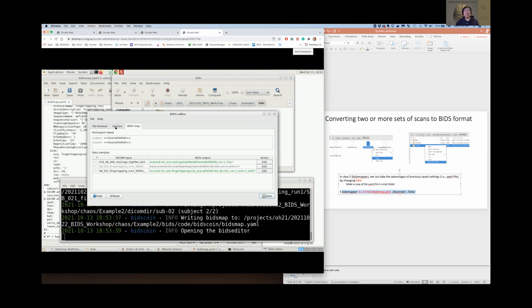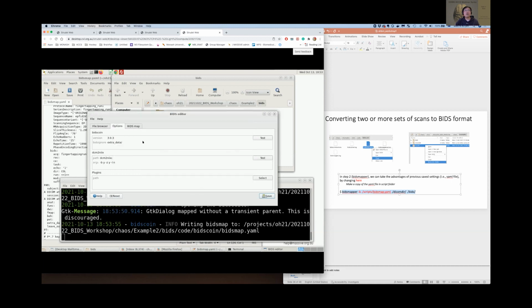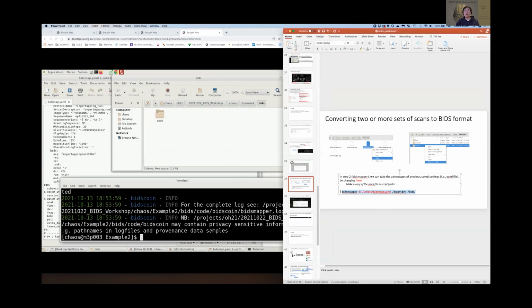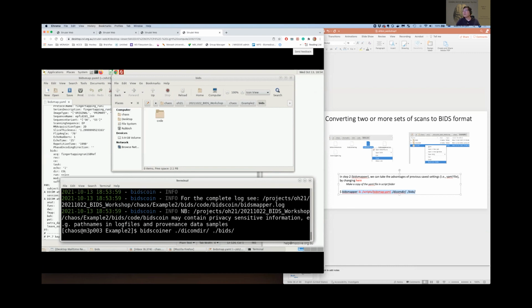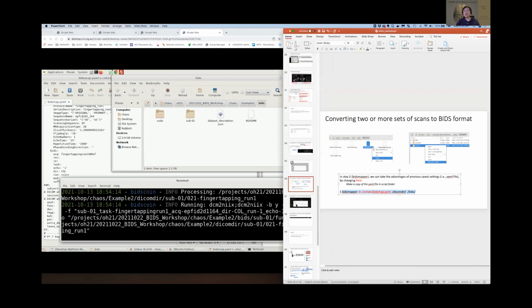Everything is here, you check this is all happy, click save, and confirm and consent. Just use this YAML file. I will update it, and now file exit, and you can just run the last bit, which is convert, let's say DICOM dir to BIDS. Done.